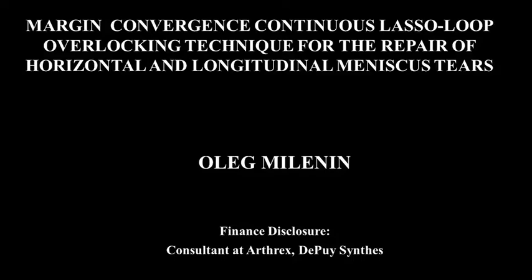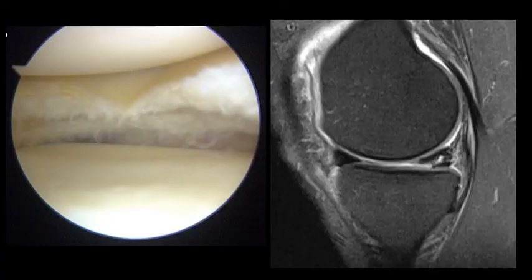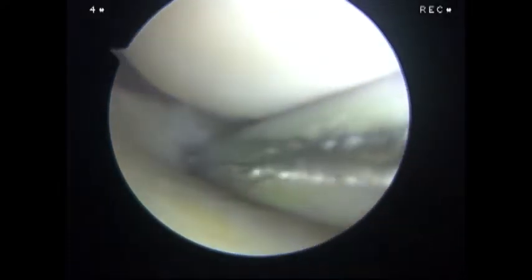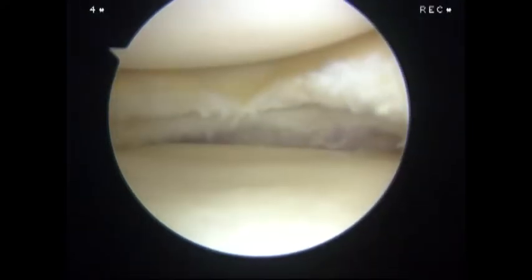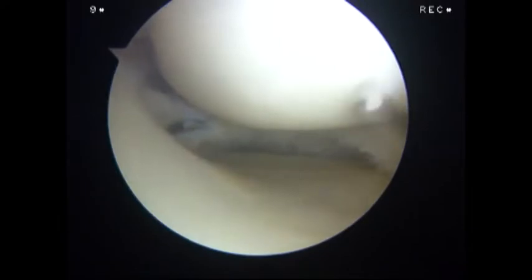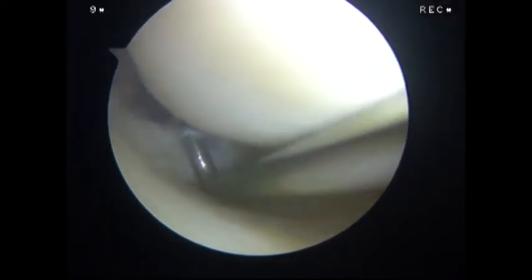We present a clinical case of continuous lasso loop overlocking repair of a horizontal medial meniscus tear. After the debridement of the tear, we insert the spinal needle with a zero fiber wire suture through the skin from the posterior medial part of the knee in the safe zone, as described in the classic outside-in technique.